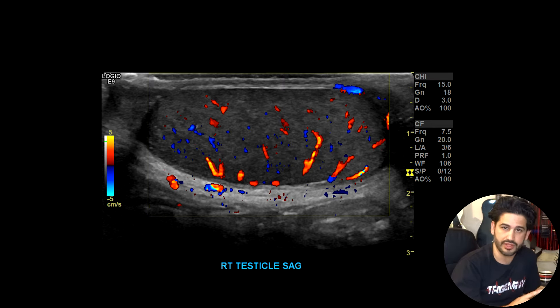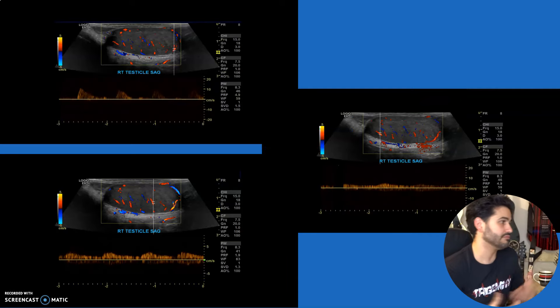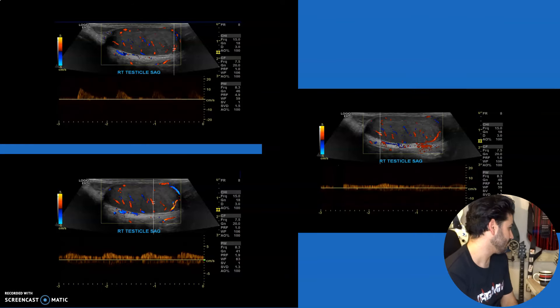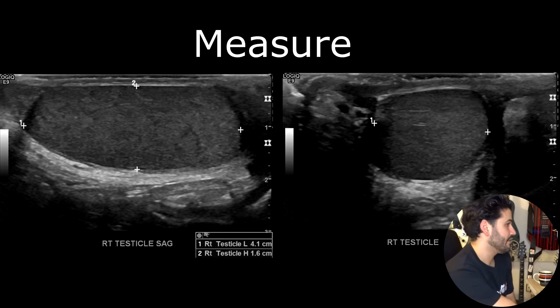As long as there's good flow within the testicle, you're good. Once you take the color doppler image, you're going to add spectral doppler. As long as there's good color flow throughout the entire testicle, you can take one spectral doppler image, though some places require several. We do superior, midsection, and inferior poles.